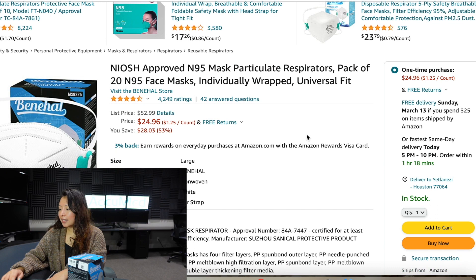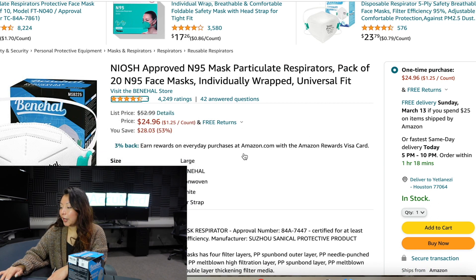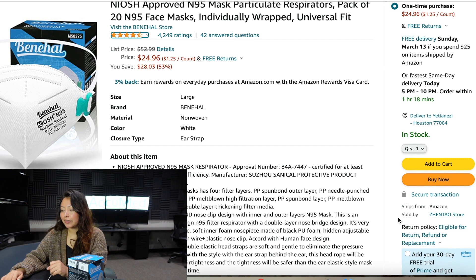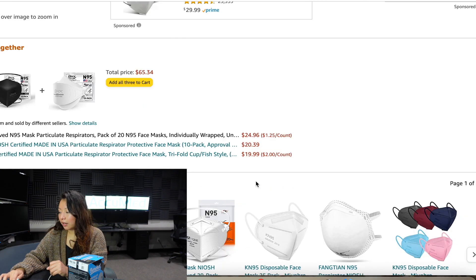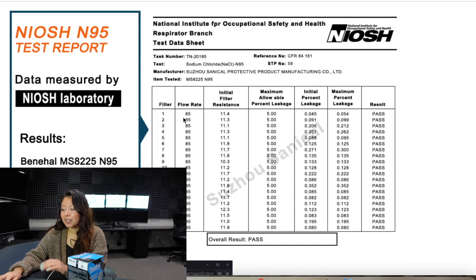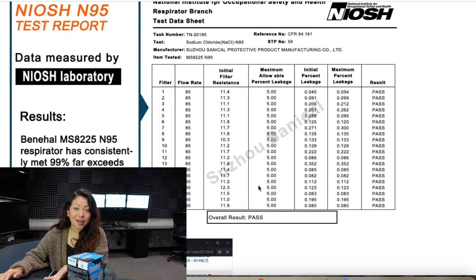Here is the Benhall listing. This mask is currently sitting at a 4.3 out of 5 rating. Scrolling down, you can see the price, which is $24.96 — $1.25 per mask. Here is the seller; this is also the person that we got it from. I have not seen this in a lot of listings — they provide you with a NIOSH test report, which basically provides you with the filtration efficiency, resistancy, and your leak percentage.